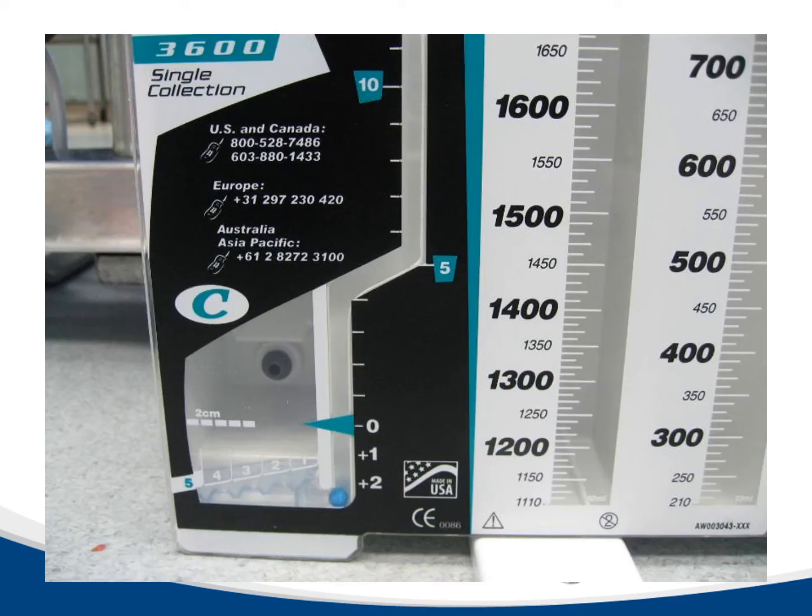To repeat, this is the CDU out of the sterile package with an empty water-sealed chamber.